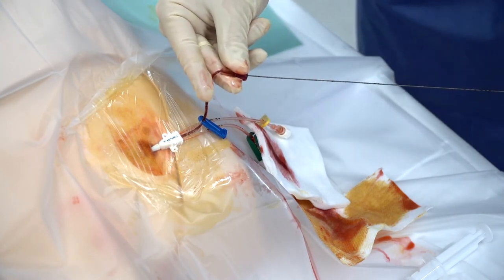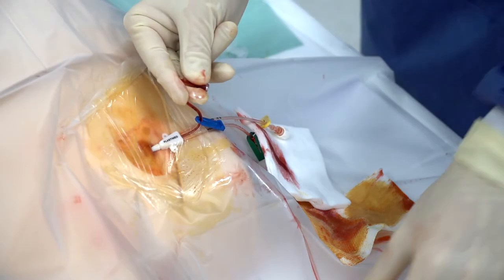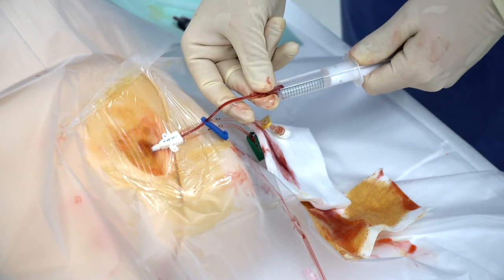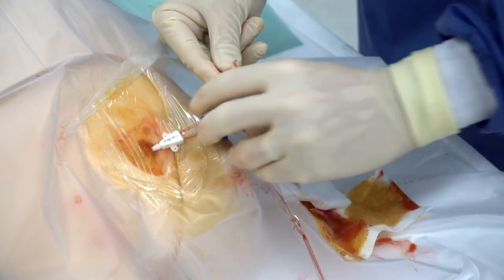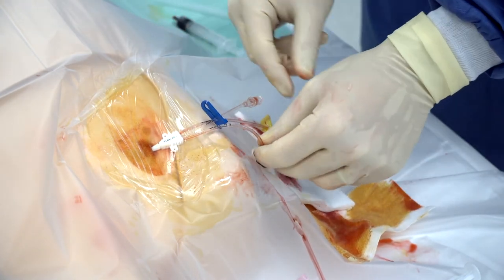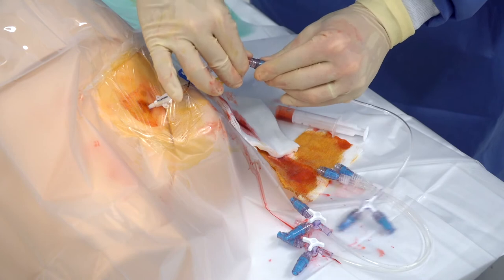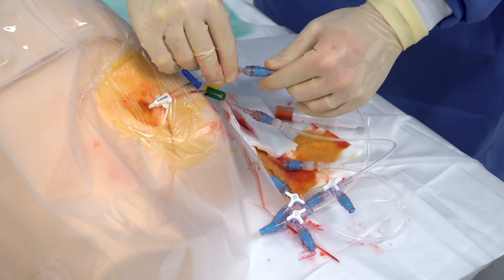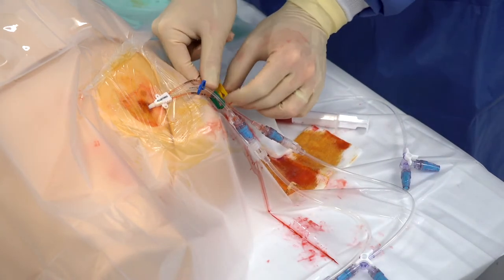Check the permeability of each line and then re-inject saline serum. Clamp the line after this injection. Screw the connectors of the three-way extension stopcock into the catheter line, then remove the clamps.